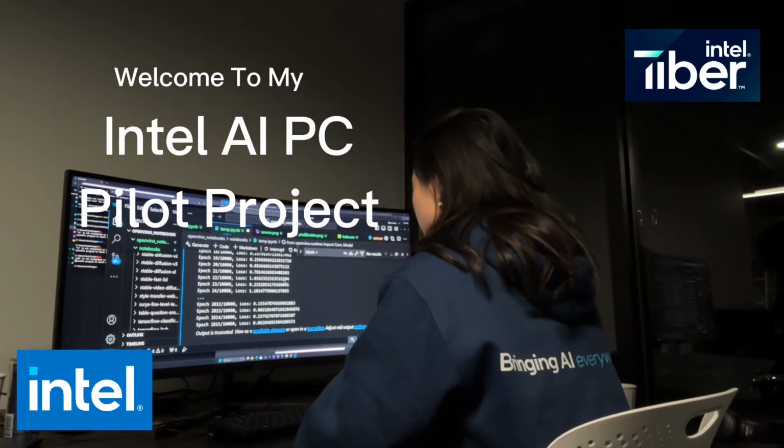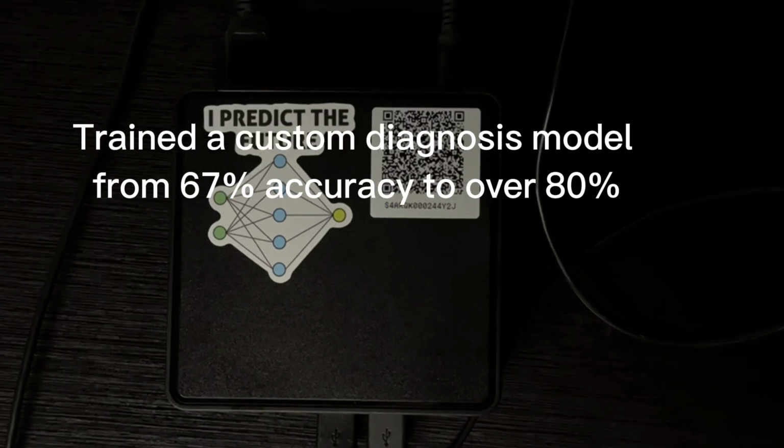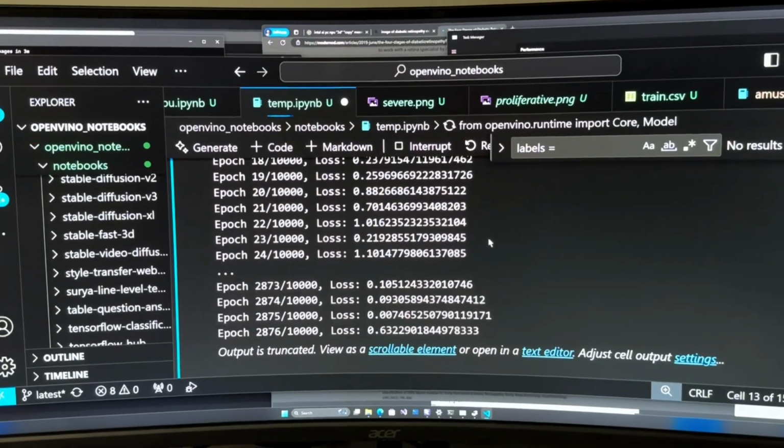Hi, my name is Audrey Chen, and welcome to my Intel AI PC pilot project. You'll see how I changed a 67% accuracy model to over 80% with the Intel AI PC.